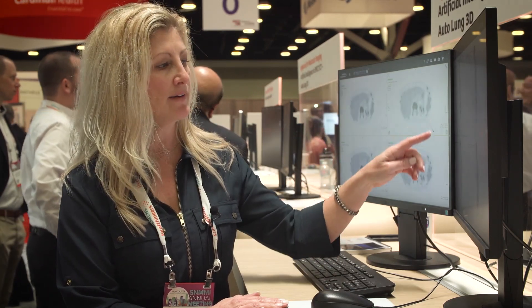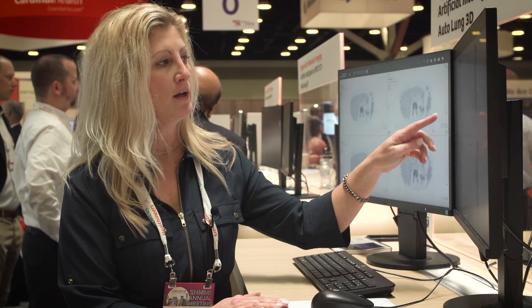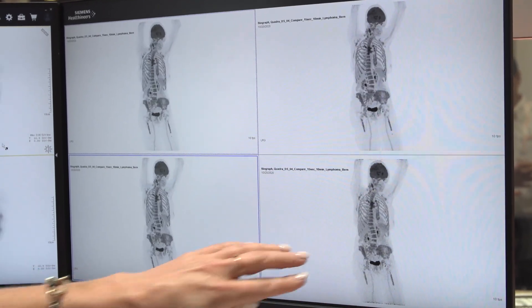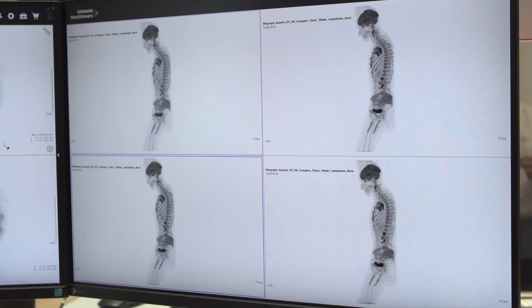To get the level of detail within the vertebra, within the pelvic activity into the bone marrow, and then see the vascular detail is truly remarkable with the less than 4 mm spatial resolution.